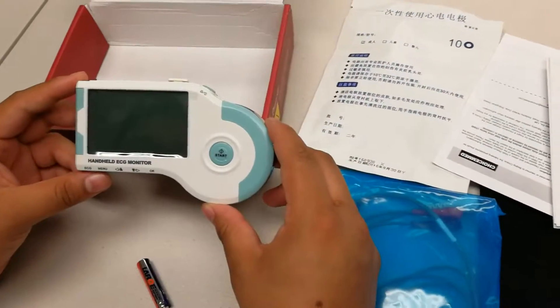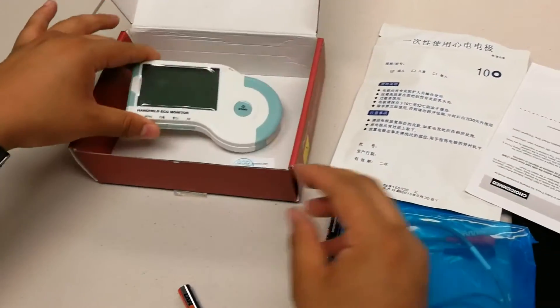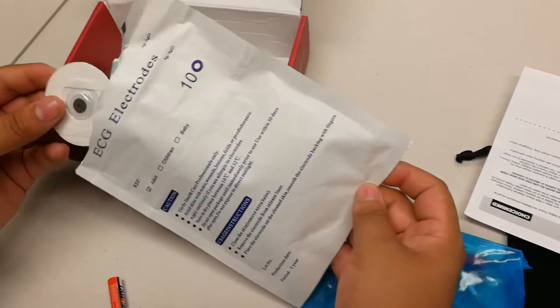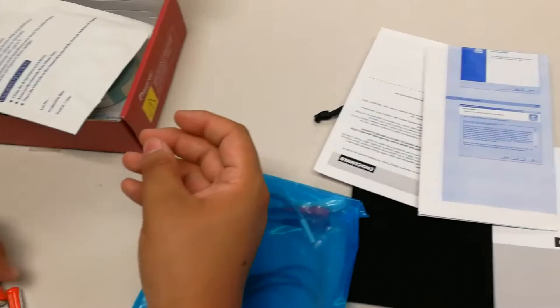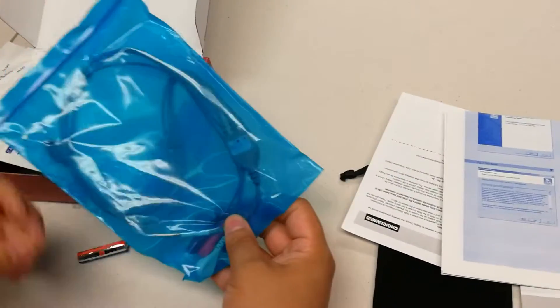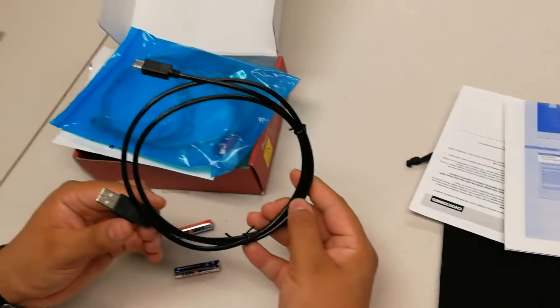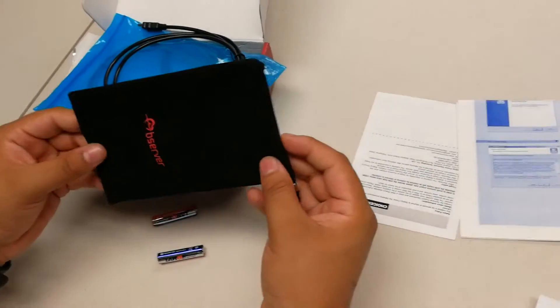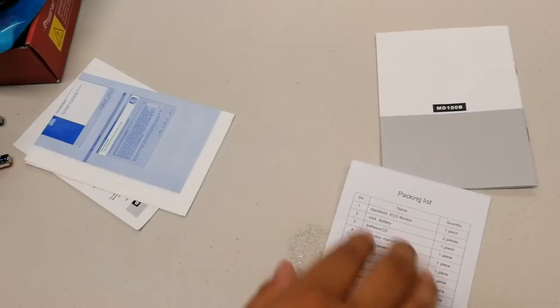Included with the FL20 are the following items: the unit itself, a package of 10 ECG electrodes which will look as following, a pair of AAA batteries, an ECG cable, a data transfer cable, a protective bag for the unit itself, a manual, and a pack list.